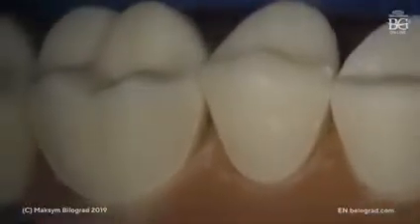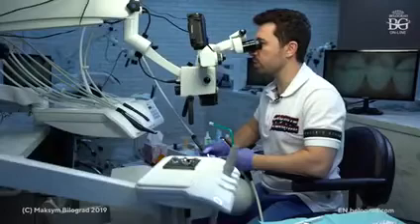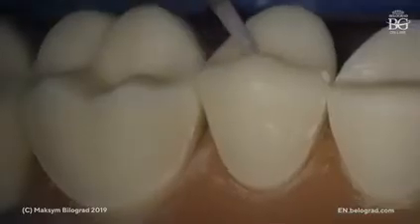And also once you touch the tip of the cast with the disc, it's too soft now. It's too much rounded. This part, I mean, this one, has to be really sharp. This has to be rounded. This has to be sharp. So let's just refine.